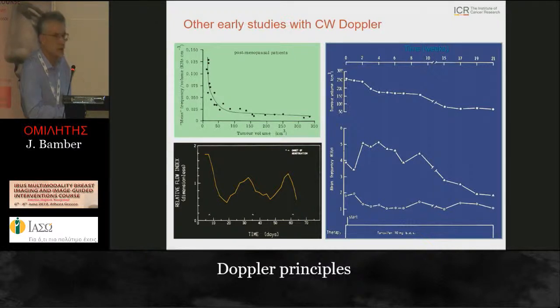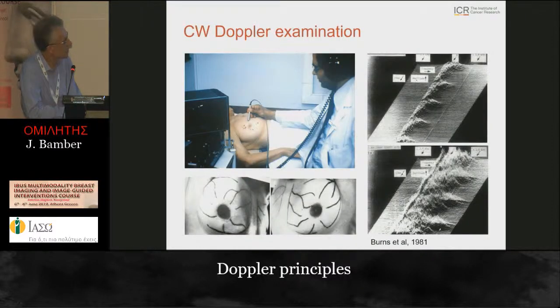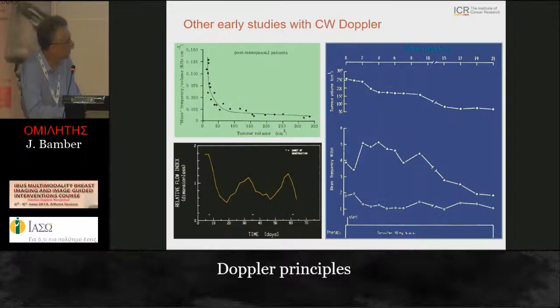And I won't show you the data, but I'll just tell you that that fluctuation is actually bigger than the difference between the vasculature in a typical tumour and the surrounding breast. And it's another reason for wanting to use the contralateral breast as a control, because typically you see this pattern being maintained in both sides, the left and right breast. And by using the contralateral breast as a control in a premenopausal woman, you can take out some of this cyclic variation from corrupting your interpretation.